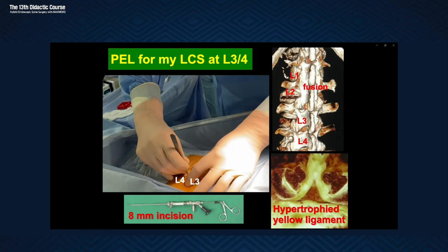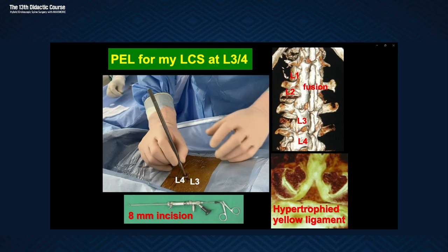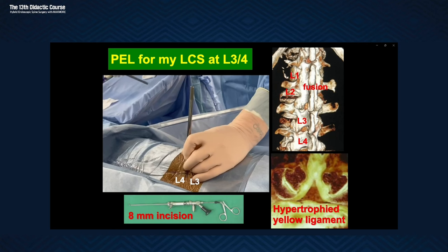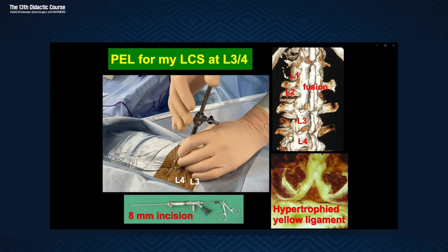Make an 8mm incision and insert a 7mm dilator into the interlaminar space. An 8mm oblique outer tube is applied from above the yellow ligament surface, while grinding the L3 lamina lower edge. Once you get used to it, you can feel the ligament surface by hand, but confirm that it is about half of the lamina wall with an image lateral view.